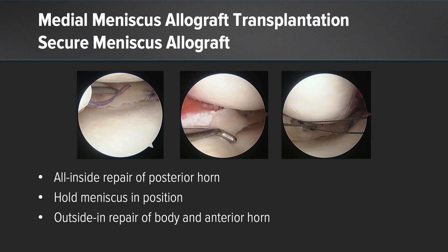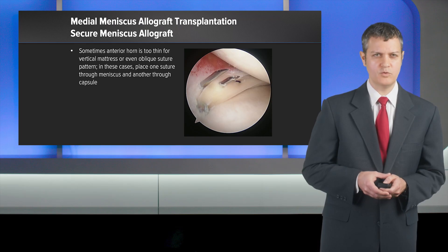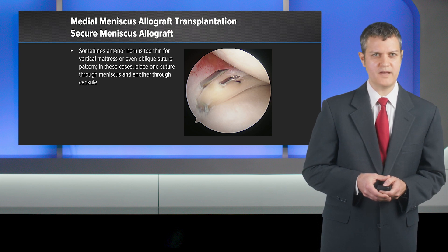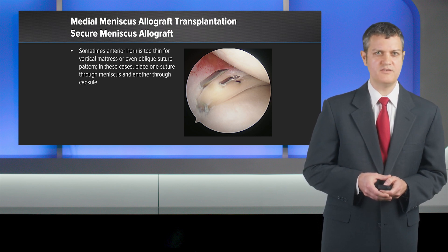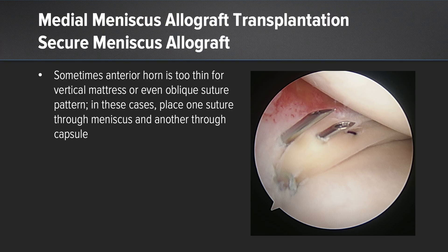The next step is to secure the meniscus allograft further. I use an all-inside repair of the posterior horn. I hold the meniscus in position and then do an outside-in repair of the body and anterior horn. For the anterior root, I place a biocomposite anchor. Sometimes parts of the anterior horn are too thin for a vertical mattress or even oblique suture pattern, and so in those cases, I place one through the meniscus and then the other through the capsule.